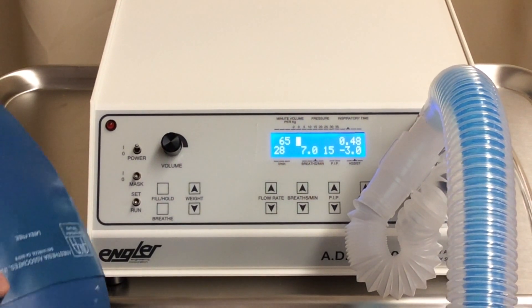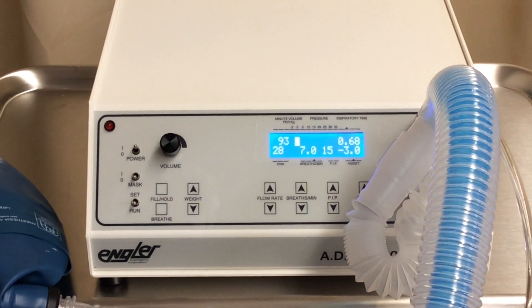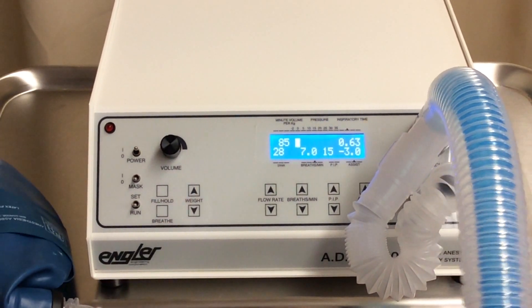That concludes our introduction of the ADS-2000. Again, keep in mind the changes we came up with are the backlit blue display and the gas sampling hose.